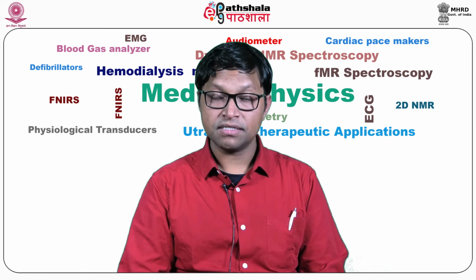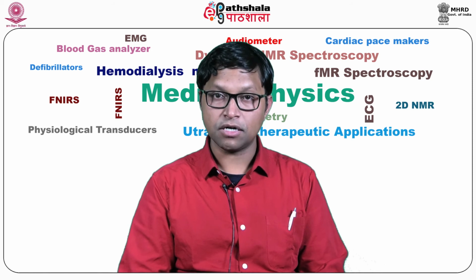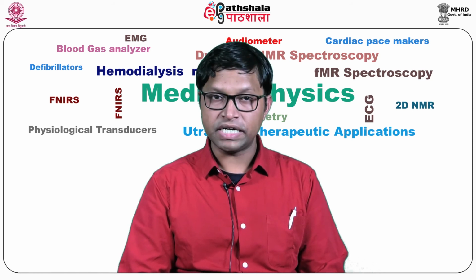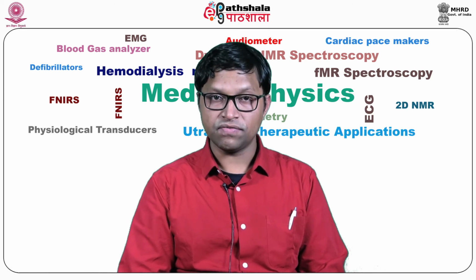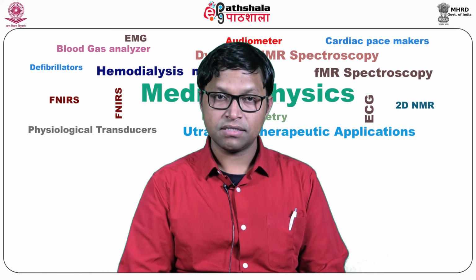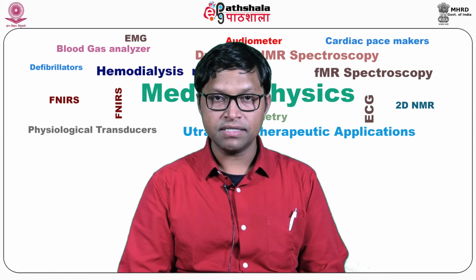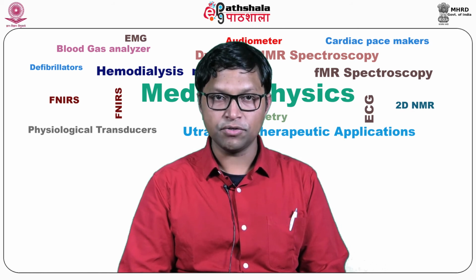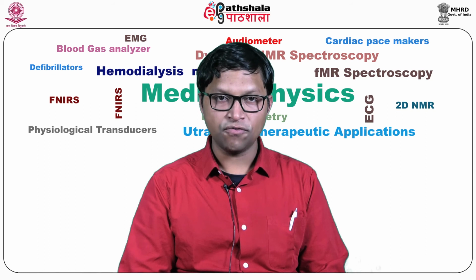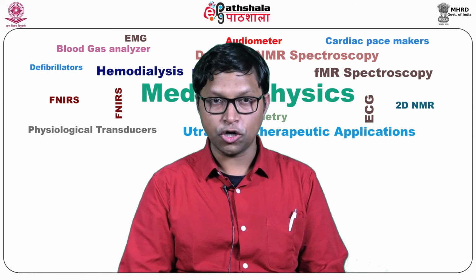The second component is the voltage reference. It is an electronic device which maintains a constant voltage. The constant voltage is maintained regardless of the temperature changes, the load on the device, power supply variations and the passage of time. The third component is the digital interface. It is the medium through which we interact with the computer. The interaction can be in the form of auditory, visual and functional components like touch or talk.